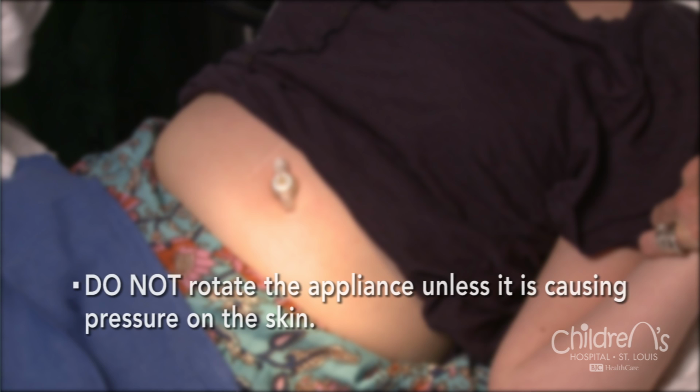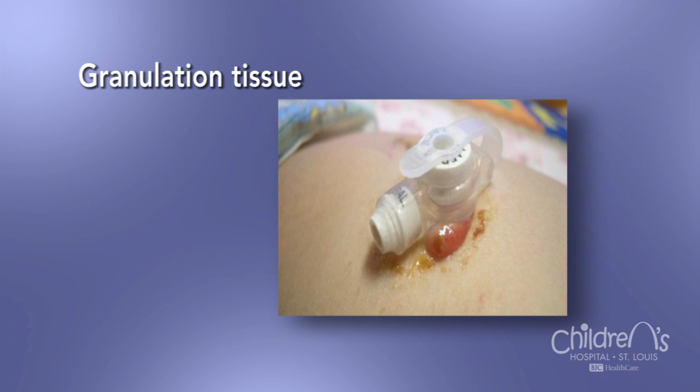Remember, do not rotate the appliance unless it is causing pressure on the skin. Rotating the device may cause the site to become bigger and develop granulation tissue. Granulation tissue is pink, fleshy tissue that forms in the healing process. If you notice drainage or redness, you should clean the area more frequently.